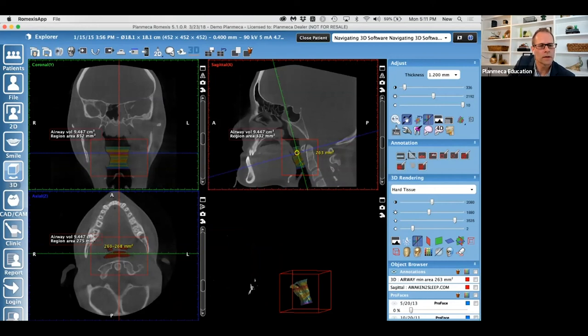Just to be clear, when we're looking for a fracture, would you use high res? That's the only time I would use it. So if I'm looking for a fracture, I'd want to use my highest resolution. I want that tube head and sensor to maximize. I want to drive that car as fast as it can, so I want to slam on the gas and put it in seventh gear. You want to think of it that way. So I want to maximize the sensor in the tube head. When I want to do that is for a fracture.